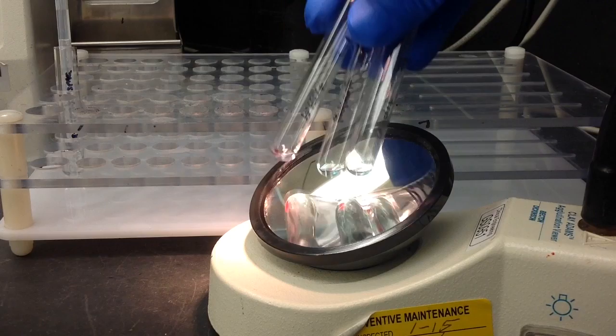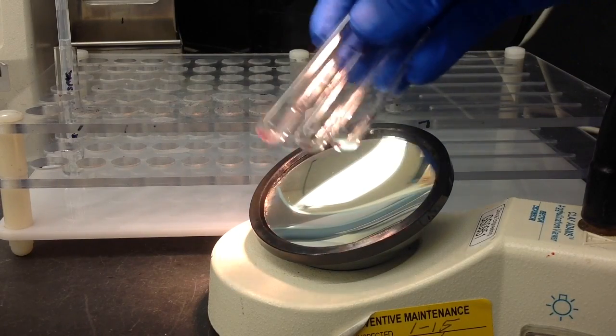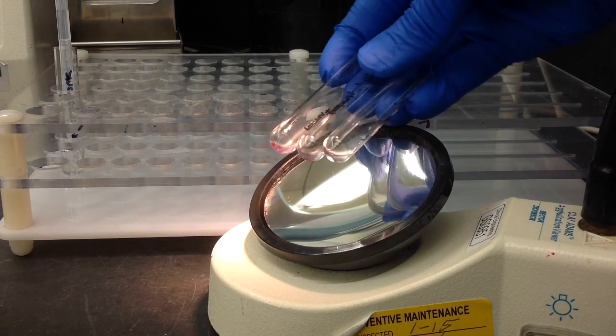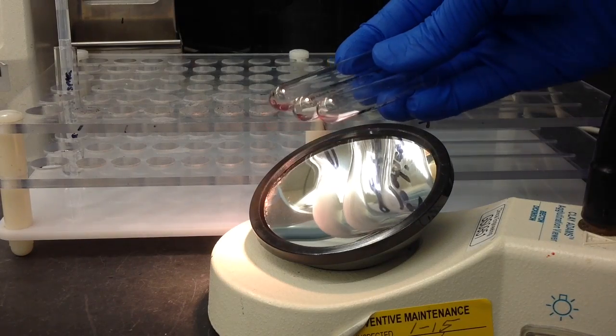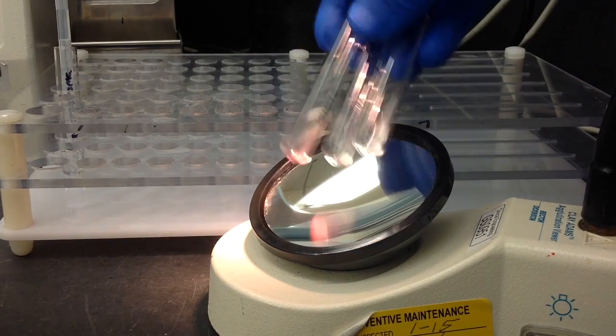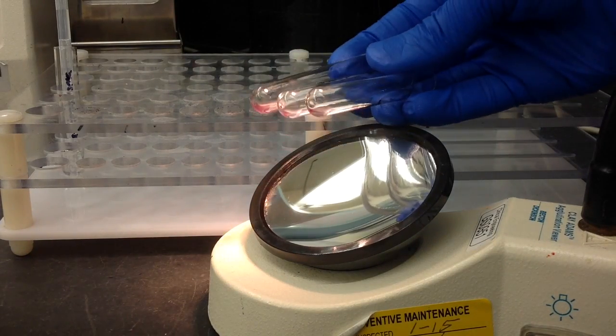...your agglutination viewer so that you can read the tubes. So resuspend your cell buttons. Since I'm using physiological saline as my patient plasma, I of course am getting zero agglutination.